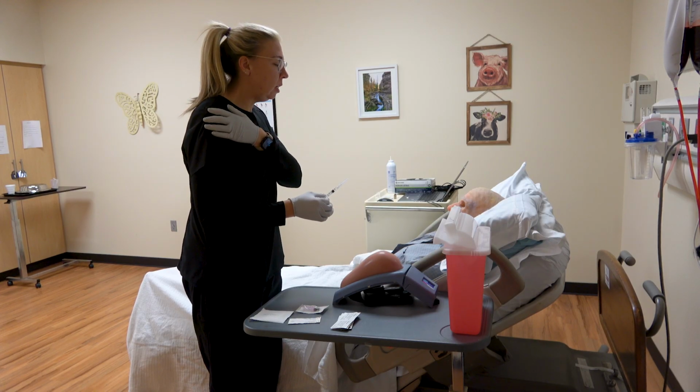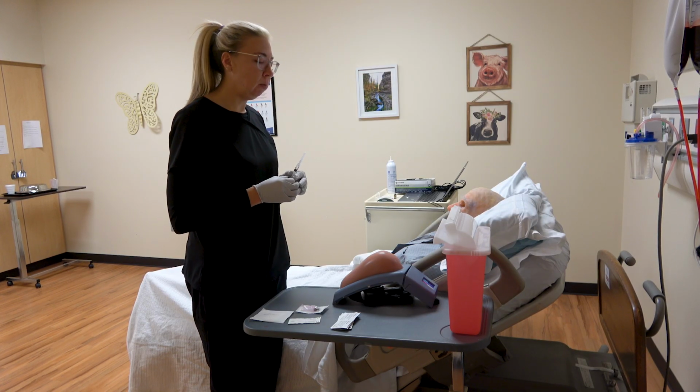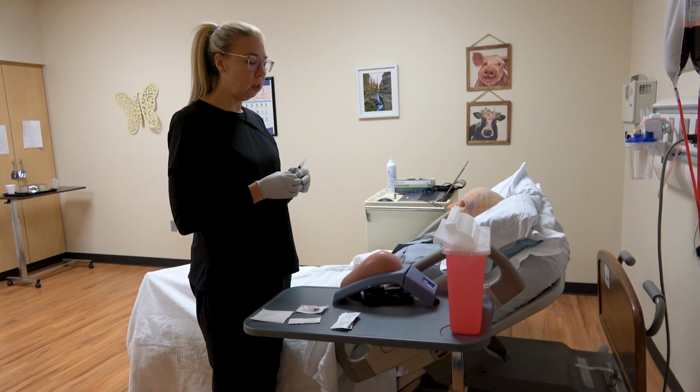We're going to go ahead and do it in your arm muscle. It's going to sting a little bit and hurt a little bit, but other than that, it should take effect within about 30 minutes. So we'll come back and check on you after that. If you experience any type of reaction or discomfort, make sure you let me know right away, okay?